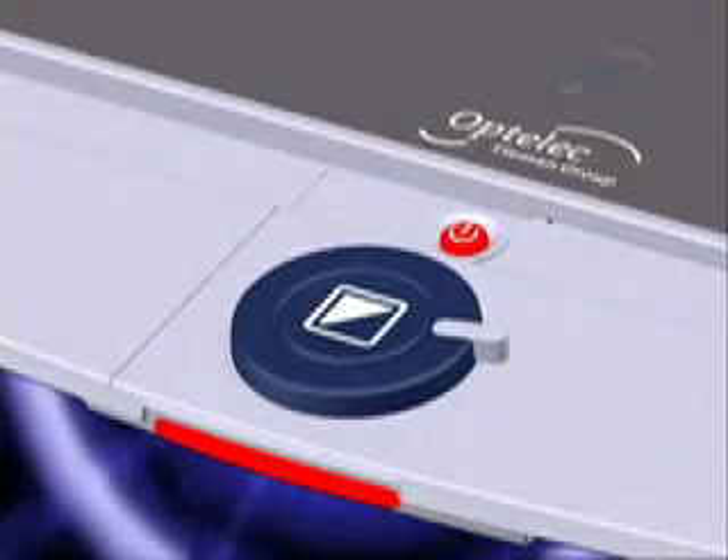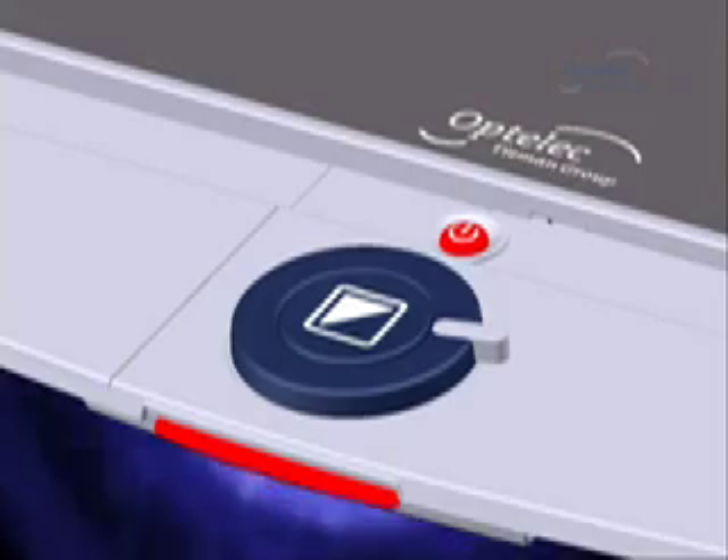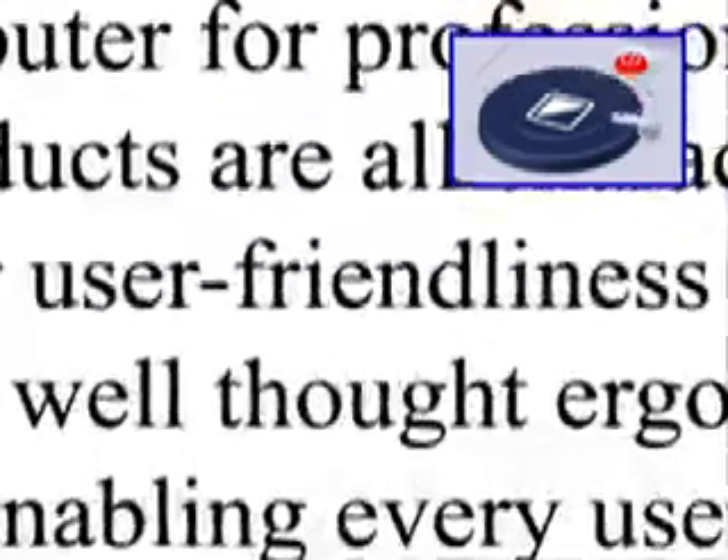It all starts at the base. The main button gives access to the most important function of the Clearview Plus: magnify. Turn the zoom control to zoom in. Press the button to change modes. Turn, press. One button simplicity.